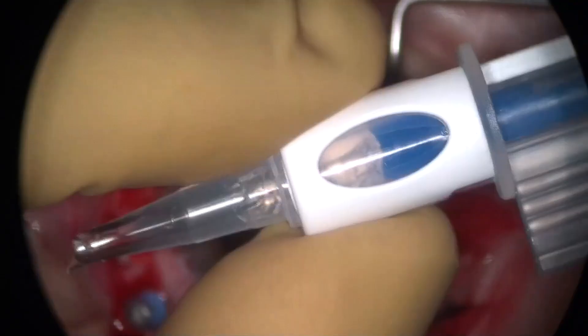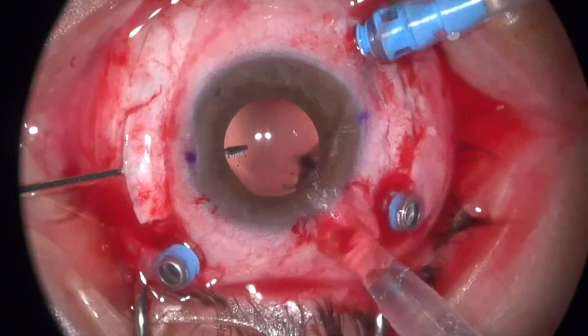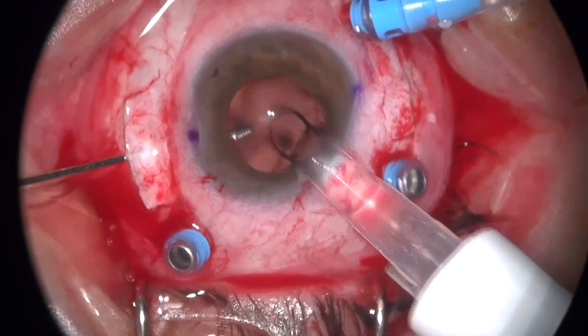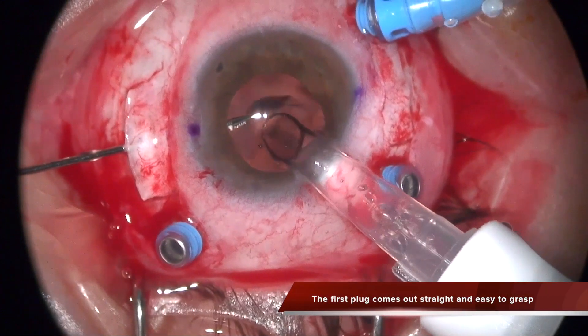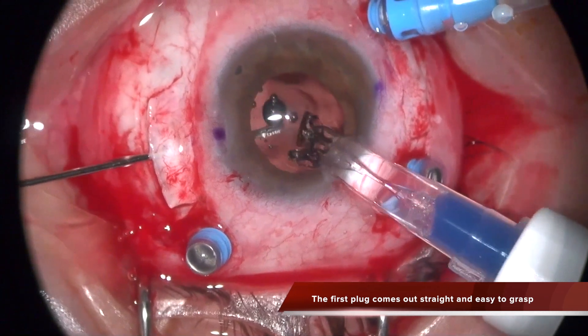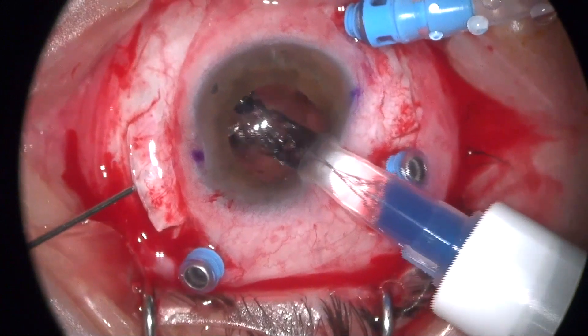This hole at the tip of the injector helps you to check whether the lens is pinched or not. When you advance the lens it unfolds and advances quite gently and smoothly. A very important upgrade is that when you inject the IOL, the first plug comes completely straight, so it is super easy to grab and take out.